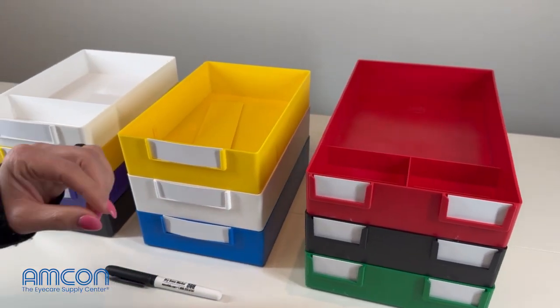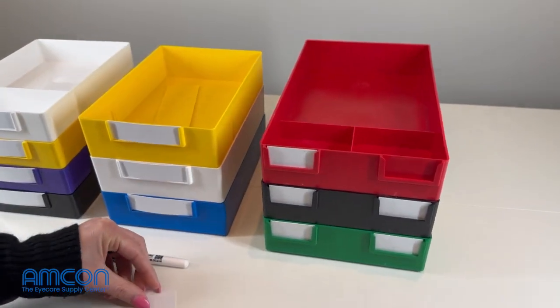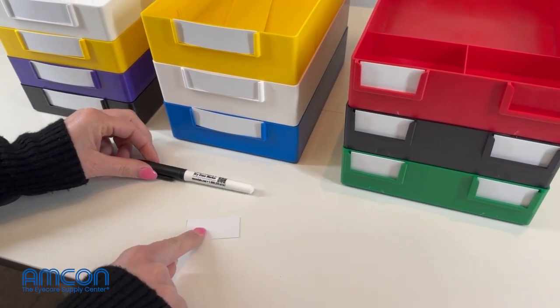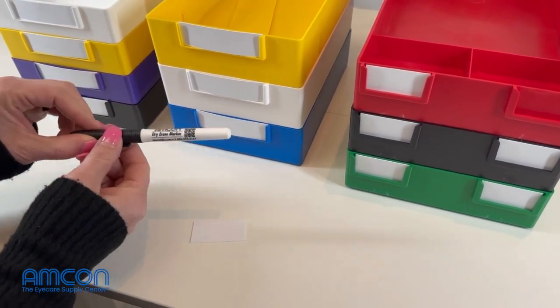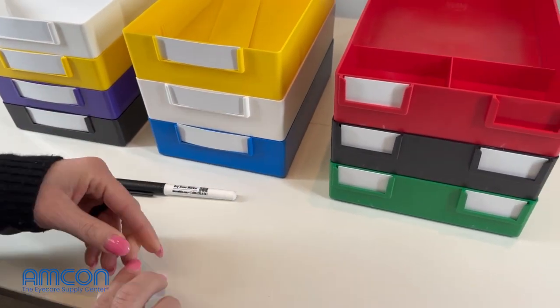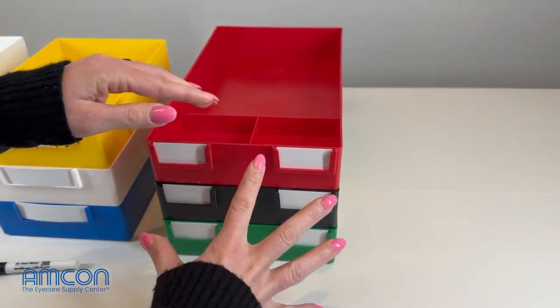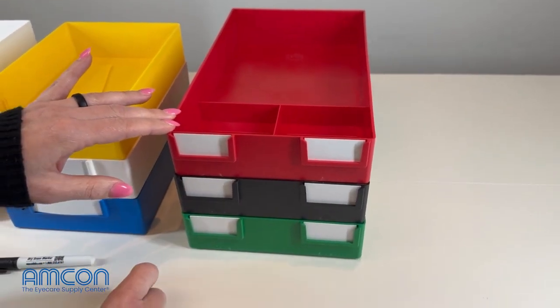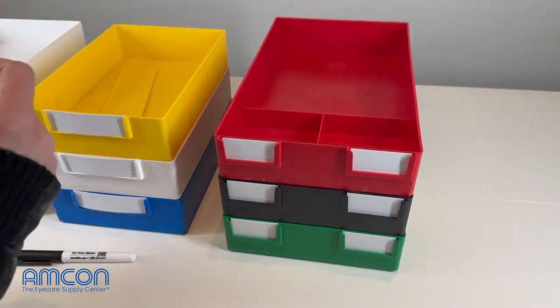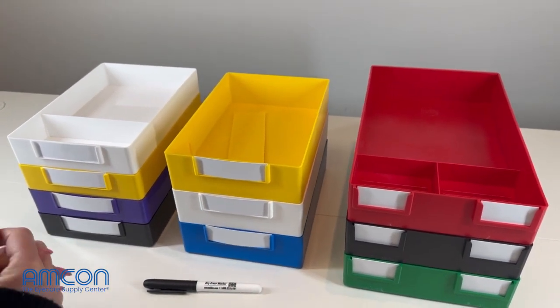All three of these job trays do have dry erasable and removable job tray tags, and each of our job tray tags will come with a marker. The markers can also be purchased separately. That way you can write whatever information you need to write on your job tray tag. Whenever you're done with that particular order, you can take that out, erase it, and start all over again.